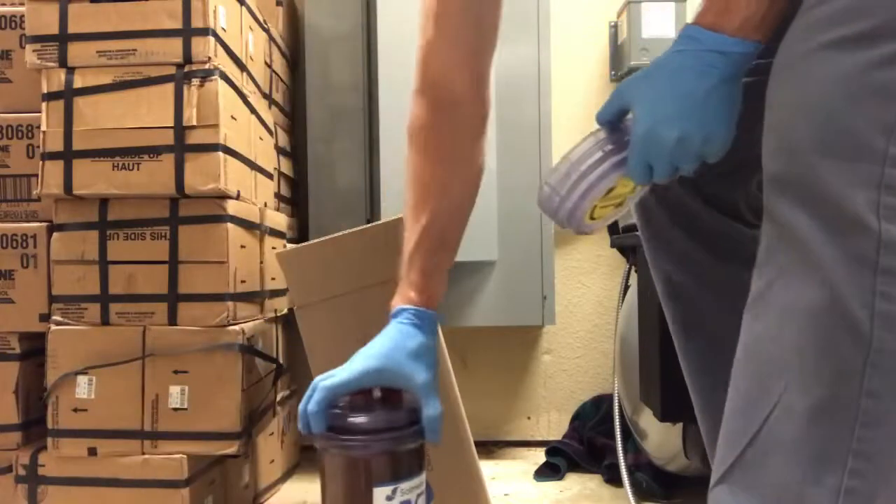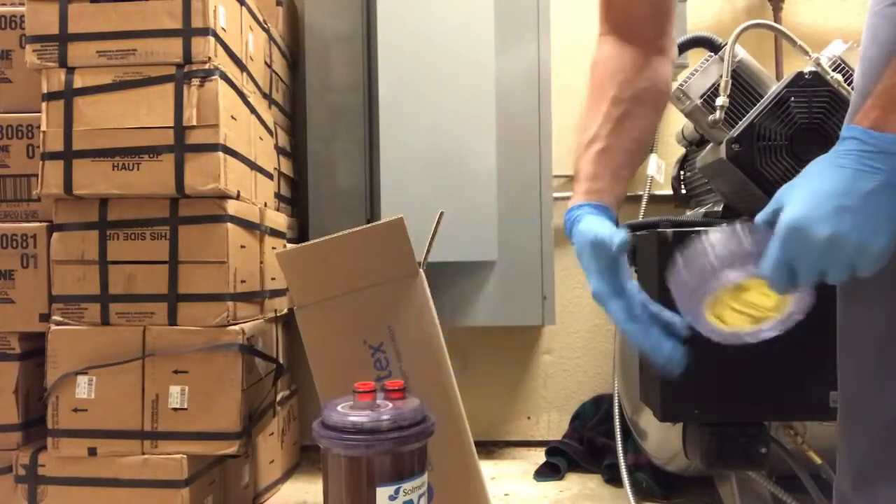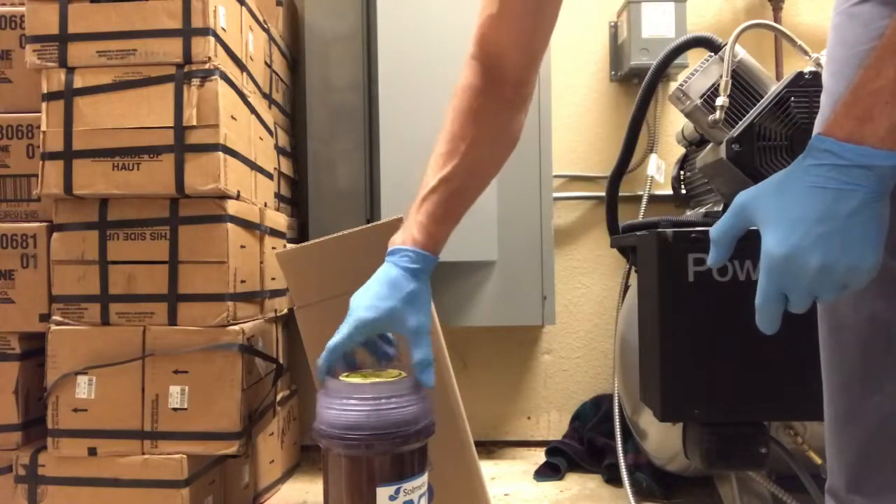Remember those red caps you saved? You're going to use them to plug the portholes on the collection canister. There's an important shipping code on this lid that you're going to screw on the collection canister.